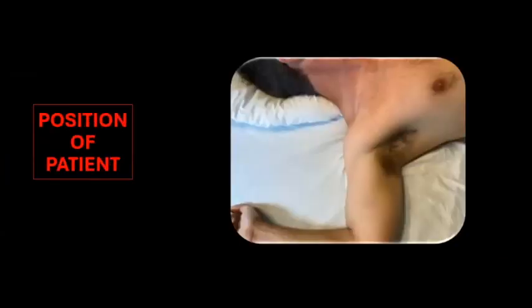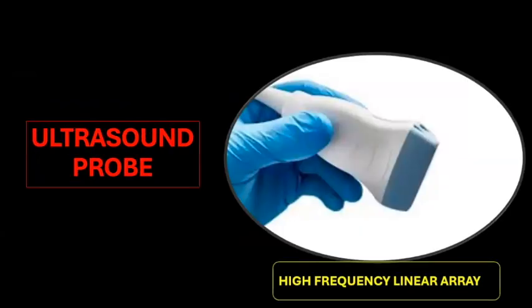Position of the patient is usually supine with 90-degree abduction at the shoulder joint and 90-degree flexion at the elbow joint. As we are targeting superficial structures, a high-frequency linear array probe is required.